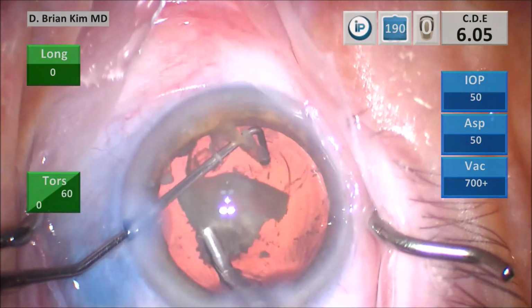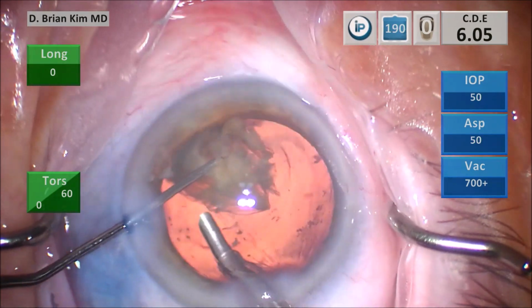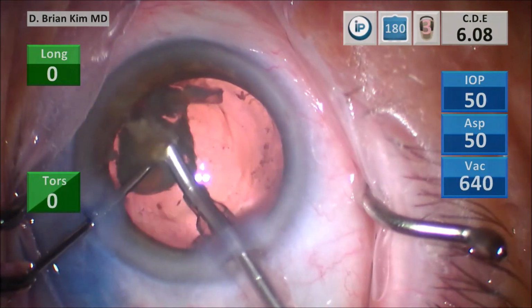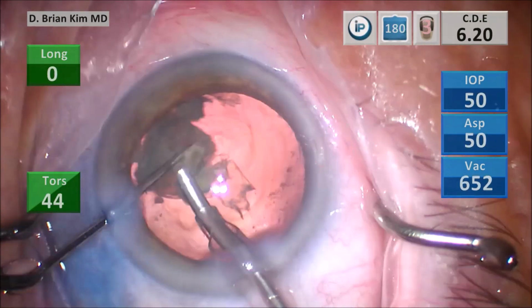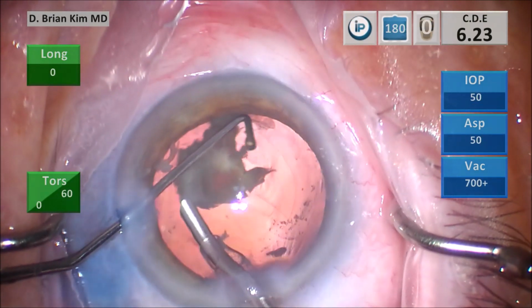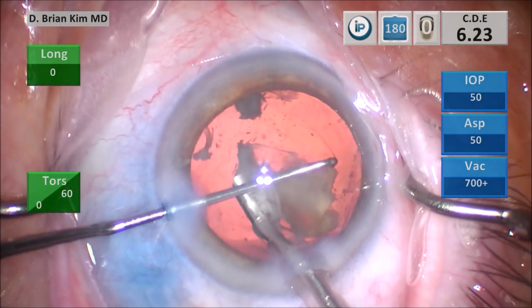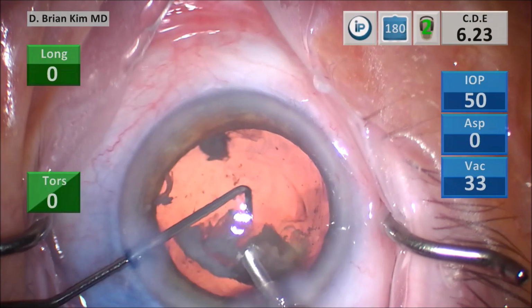So I'm positioning that last fragment between the chopper and the phaco tip. Again, this is under irrigation only, breaking it up into smaller and smaller pieces, and then grabbing it with a little vacuum, sandwiching it between the chopper and the phaco tip, and then emulsifying the lens piece.